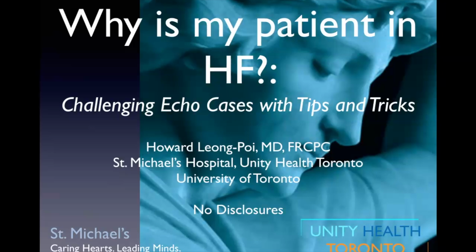I'm going to hopefully share with you 3 cases. There's a fair bit of data on each of them, so hopefully we'll be able to get through. And I'll try and make it more interactive, particularly in the room. So I might ask people to give their opinions. I was going to lean on the echo fellows, but there's only one here. So, two. There's Yazid. Okay, perfect.